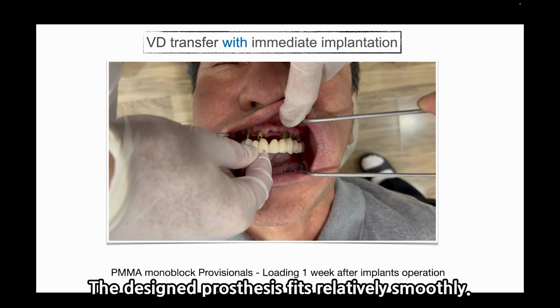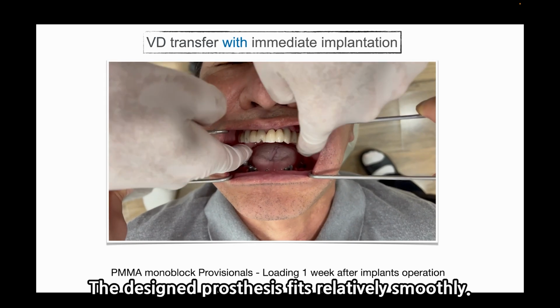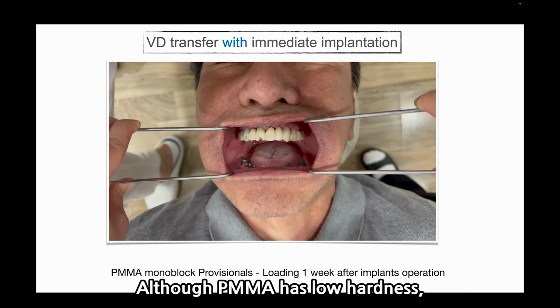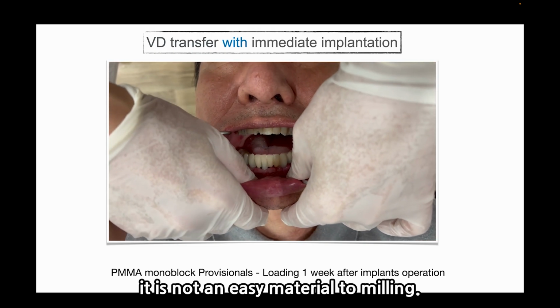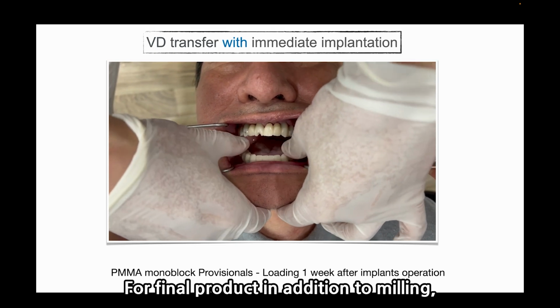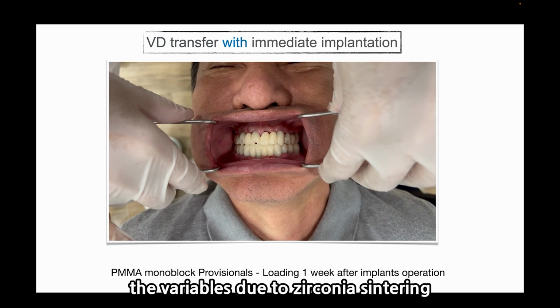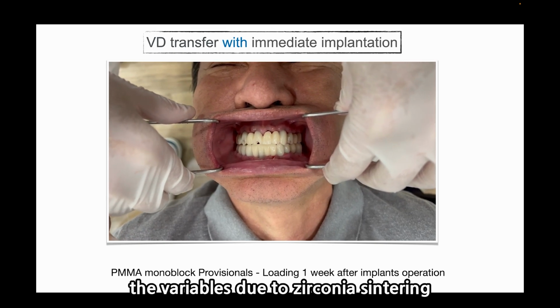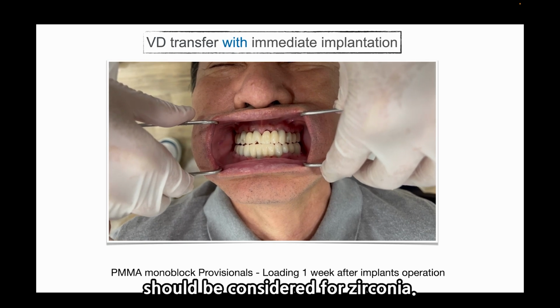The designed prosthetics fit relatively smoothly. Although PMMA has low hardness, it is not an easy material to mill. For the final product, in addition to milling, the variables due to sintering should be considered for zirconia.